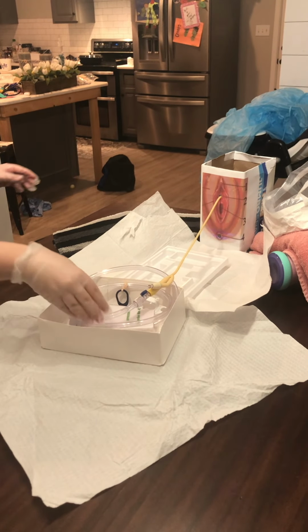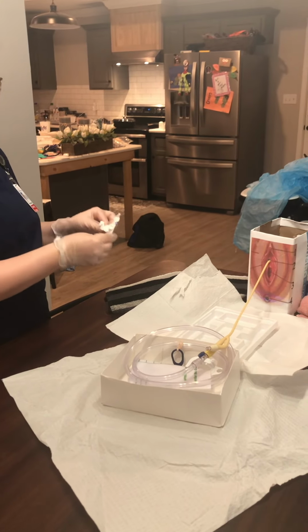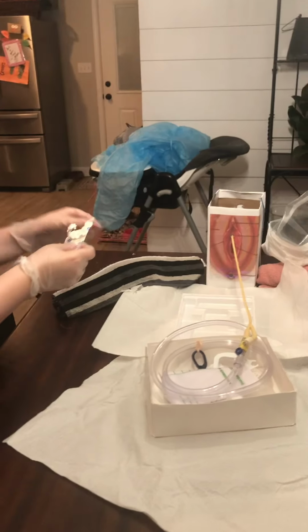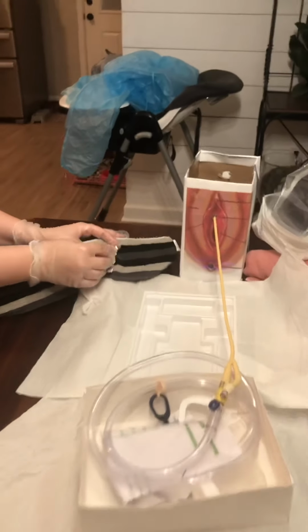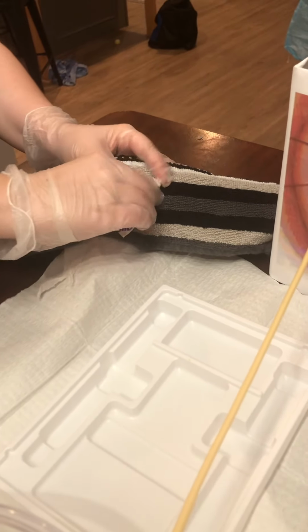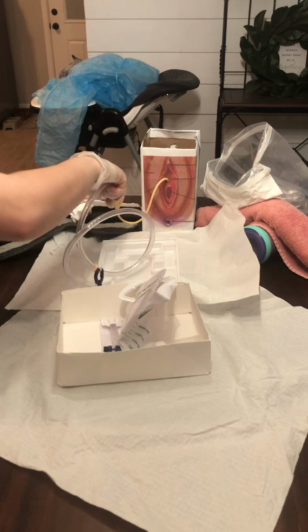So now I'm going to get my StatLock. My StatLock is very ripped because I was practicing earlier with it. But I would clean the thigh with an alcohol swab and then put it there. Then I'm going to show you how to open and close it. So just zoom in. There's closing it and then open. So I'm going to put my bifurcation in there.